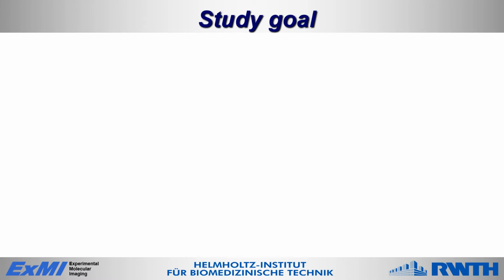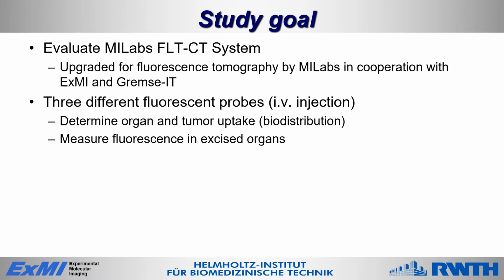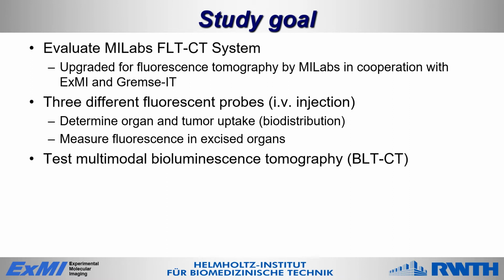The goal of our study was to evaluate the MILabs FLT-CT system, which had been upgraded for fluorescence tomography by MILabs in cooperation with EXMI and Gremse IT. We used three different fluorescent probes with IV injection to determine their organ and tumor uptake, and then afterwards measure the fluorescence in excised organs. And we wanted to test the multimodal bioluminescence tomography features.